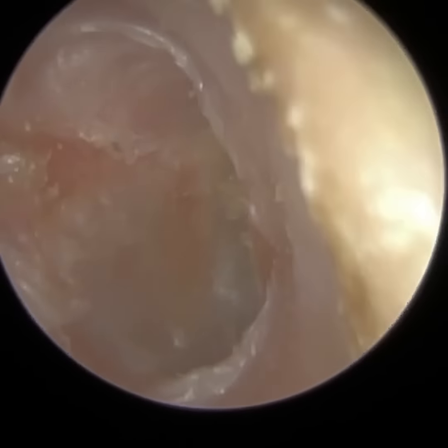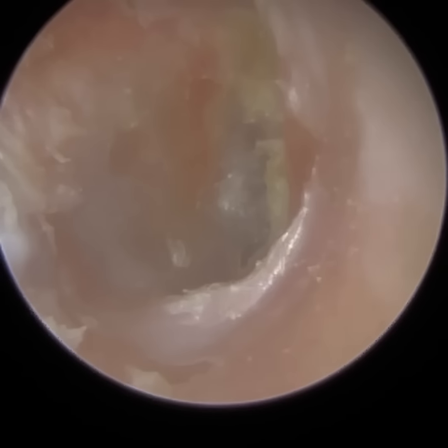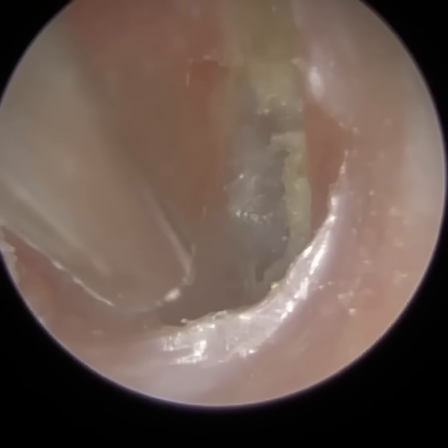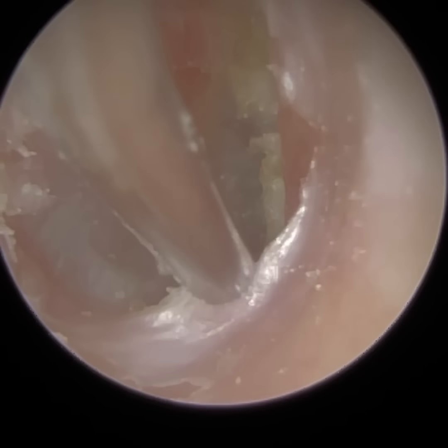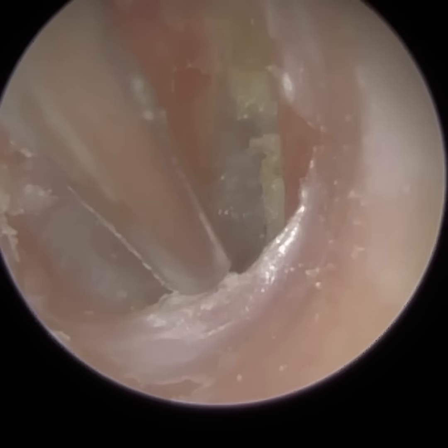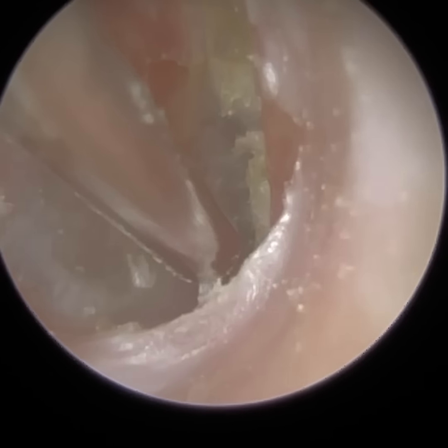So I think, let's see, I'm going to angle it now. I've also re-angled the endoscope. I just want to really get into that corner. Yeah, I can see the angle on the fine end. It'll become more prominent in a minute. Again, I just want to make sure there's no underlying canal cholesteatoma.